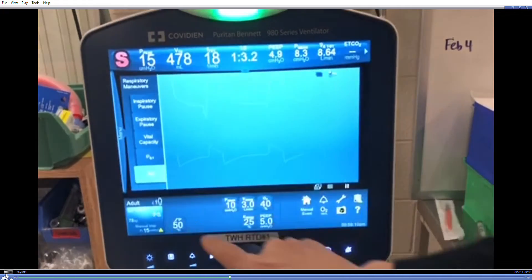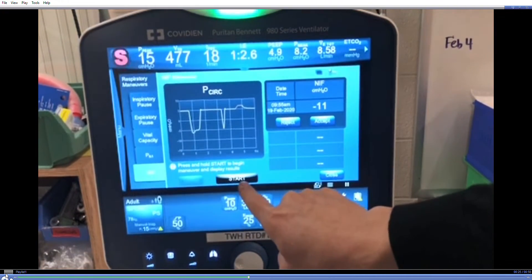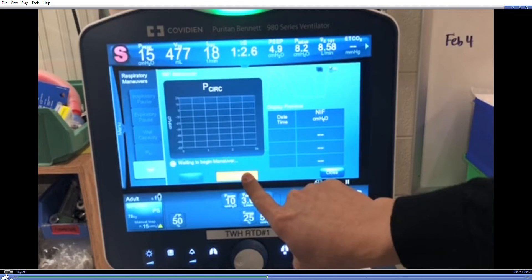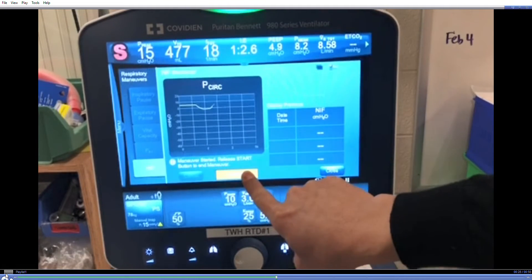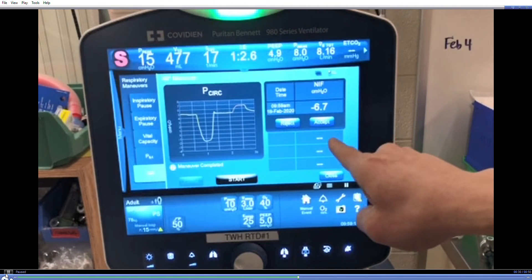For PEOC, choose the NIF tab, then press and hold the start button until the patient makes an effort and then release. The displayed value is the maximum detected effort. If the patient made more than one effort, this number may not be reflective of the first effort.